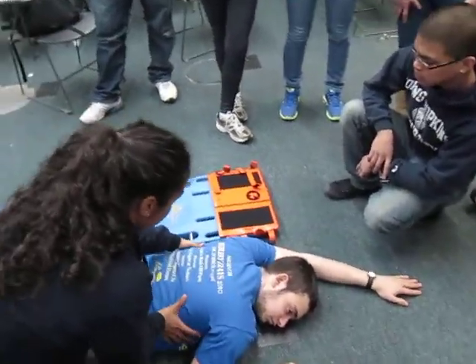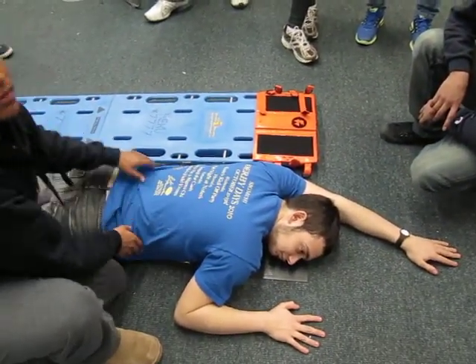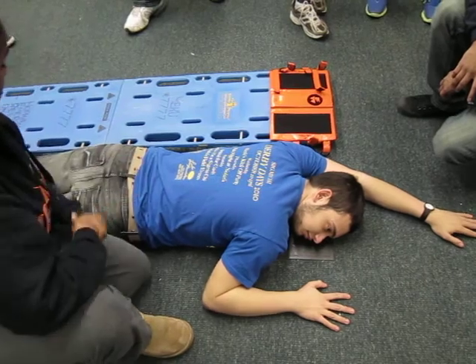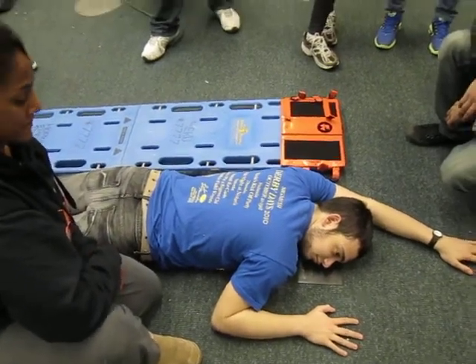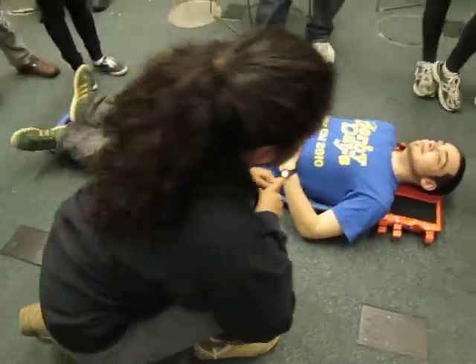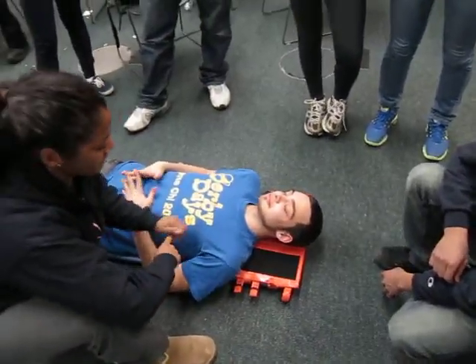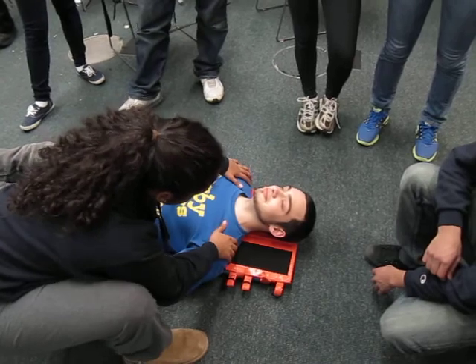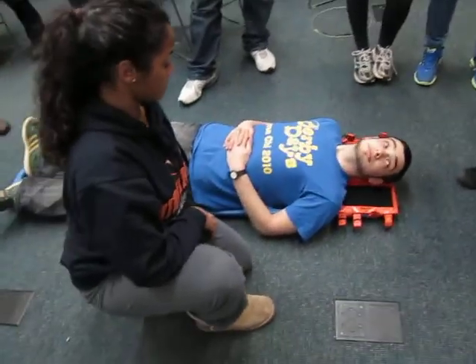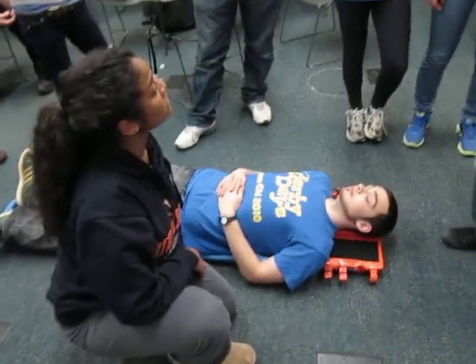You're looking for all the relevant injuries. She can still do equal chest rise and check the back. She can't check the abdomen from the back, but she can do the pelvic — inward motion only. She can't see the groin, but she can go down all the extremities. Once he's on the board after rolling, Kayla does a front physical — inspecting the eyes, jugular, trachea, rib cage, clavicle, and sternum. Once she's done with the front, she goes ahead and puts on the collar.